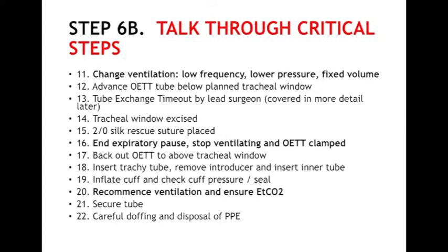The latter may be useful to stop ventilators cycling higher pressures if they determine that a disconnection has occurred. Without deflating the cuff, the oral endotracheal tube is advanced towards the carina, the predetermined distance. It should now lie below the planned tracheal window.